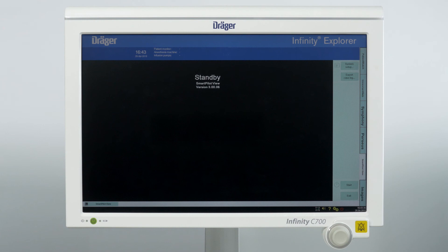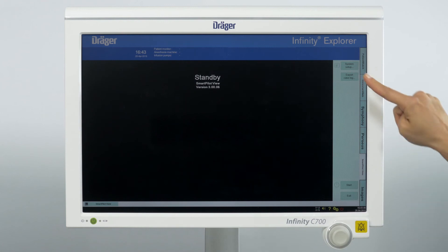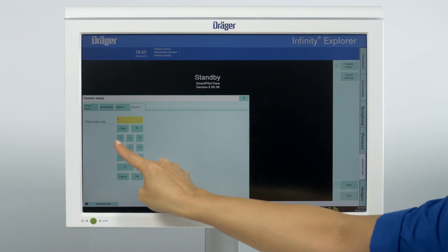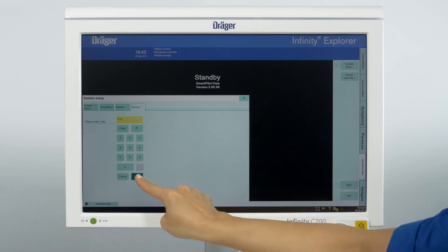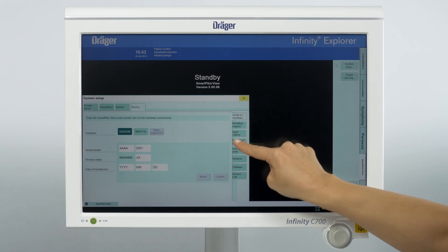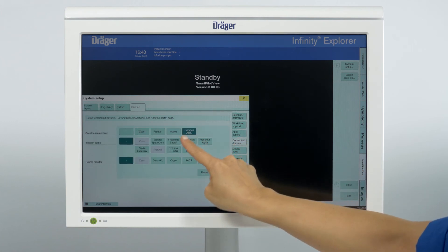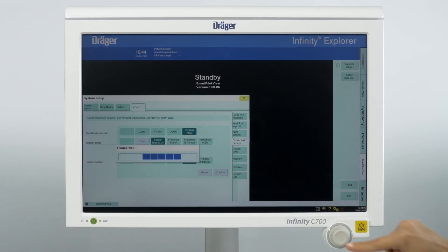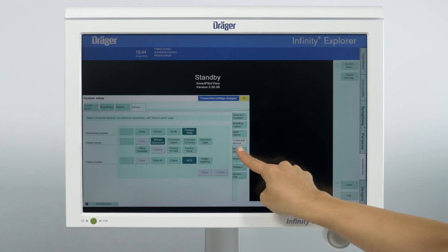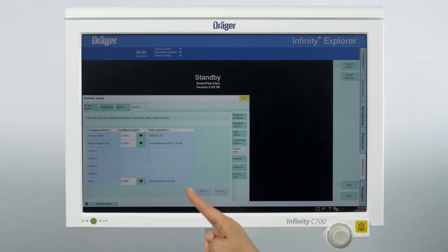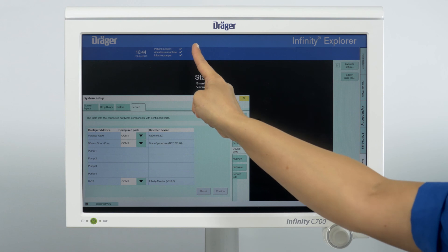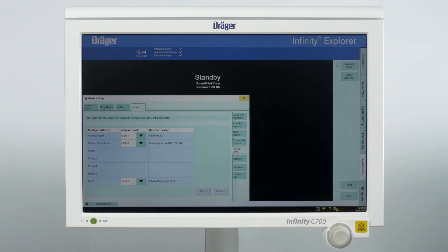You can check the connectivity status on the SmartPilotView screen. Make sure all connected devices are switched on. Go to SmartPilotView System Setup and press Service. Enter the code 1756 and press OK. Go to the Connected Devices tab, select the devices you want to connect, and then confirm. Go to the Device Ports tab to see the devices, ports and software version. On the top blue bar, you can see the check marks for connected devices.